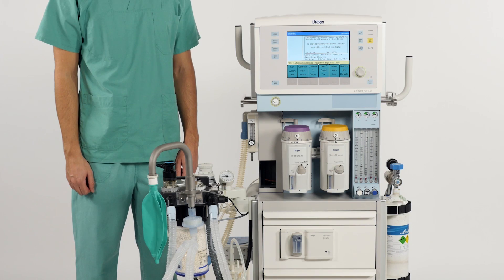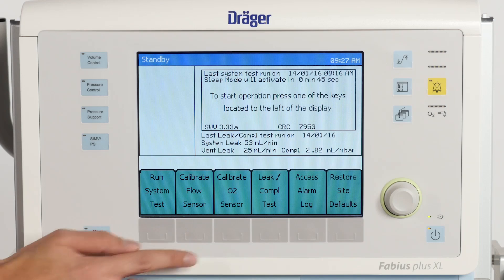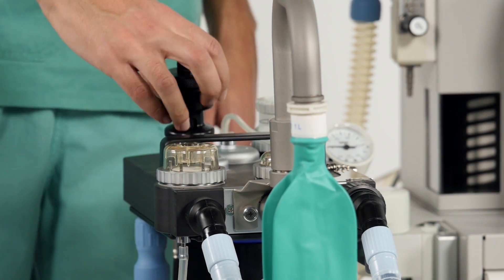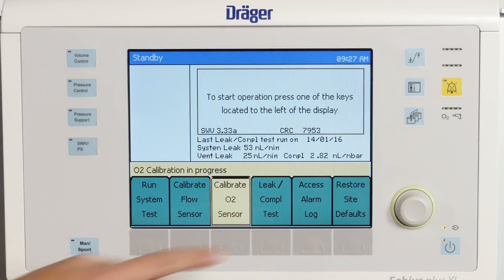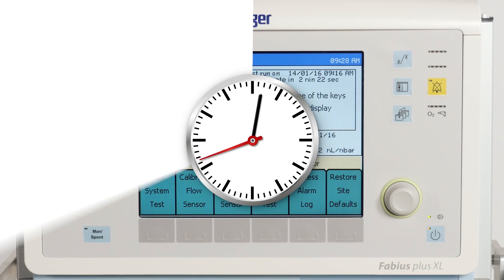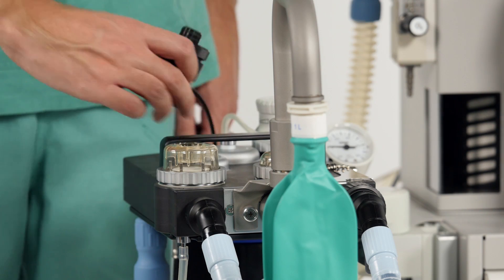Additionally, make sure to calibrate your O2 sensor every morning. To do so, simply select Calibrate O2 sensor. Remove the O2 sensor from the housing for 2 minutes and press the rotary knob to confirm. After the test, reinsert the oxygen sensor onto the breathing system.